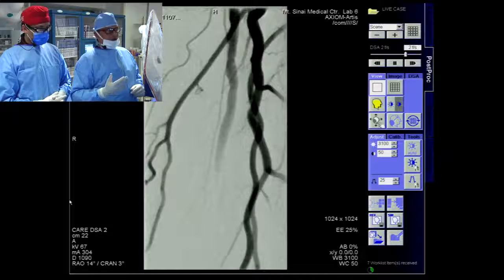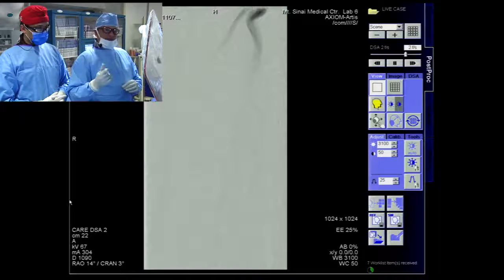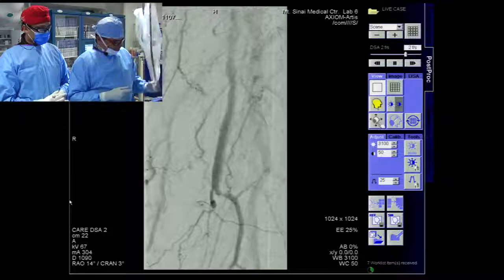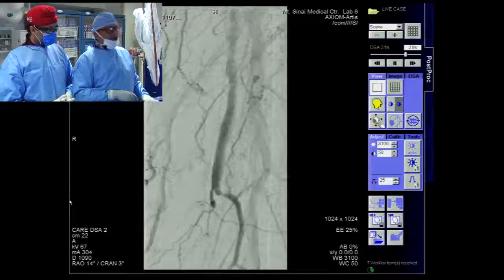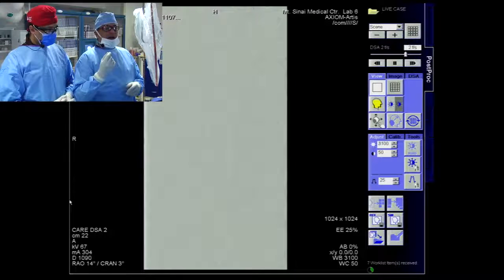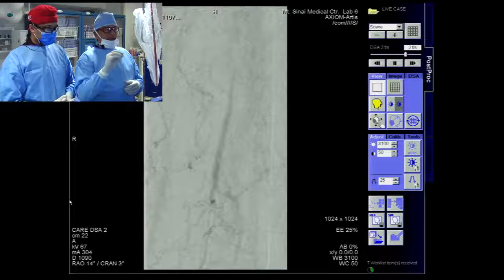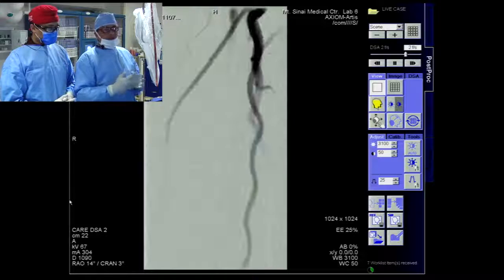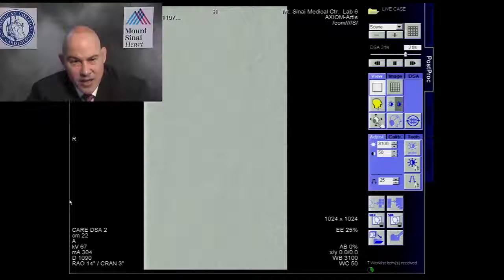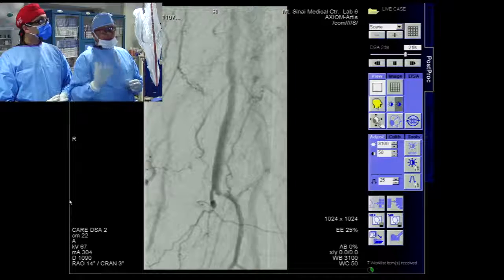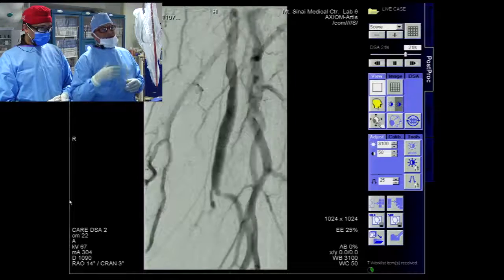Dr. Guja and I decided to go for a true luminal approach, using a torquing catheter that finds fenestrations within the plaque. There are multiple true luminal devices available: one uses rotation to find fenestrations; another uses OCT technology with a boring mechanism; a third uses jaws to push aside plaque; and a fourth uses a rotational wire with a diamond tip. We're interested in an intraluminal cross if possible.